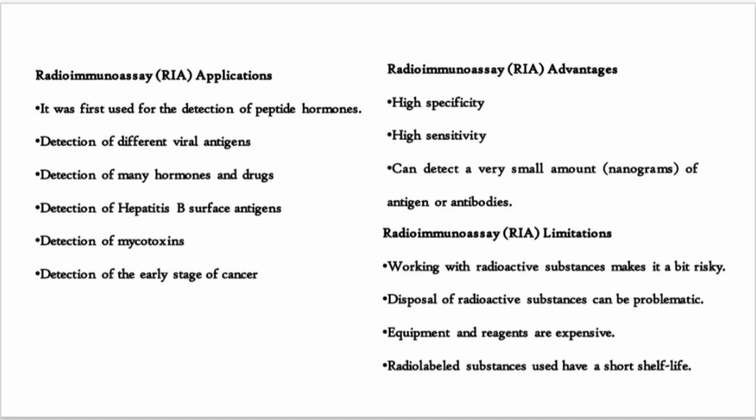RadioImmunoAssay RIA applications: it was first used for the detection of peptide hormones, detection of different viral antigens, detection of many hormones and drugs, detection of hepatitis B surface antigens, detection of mycotoxins, and detection of early stage of cancer.